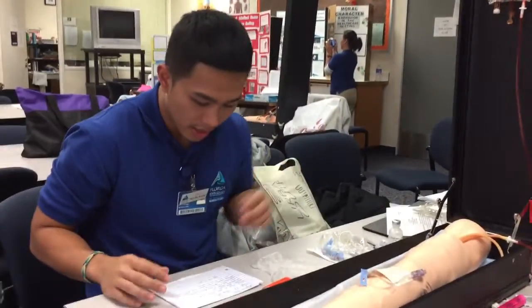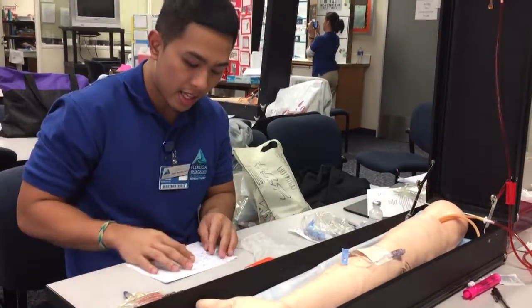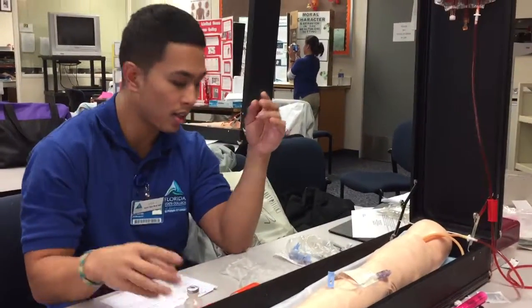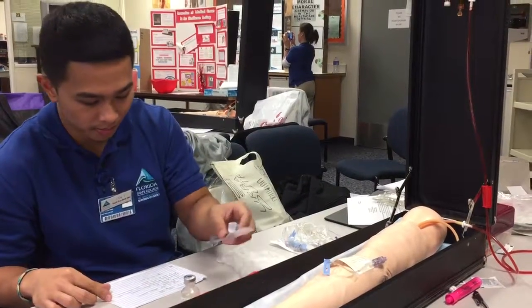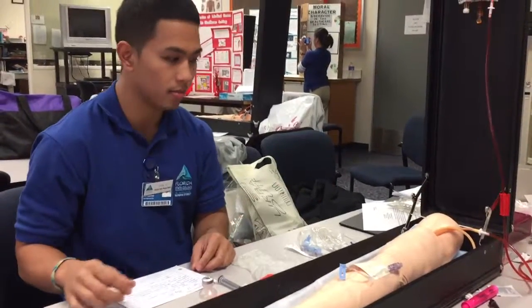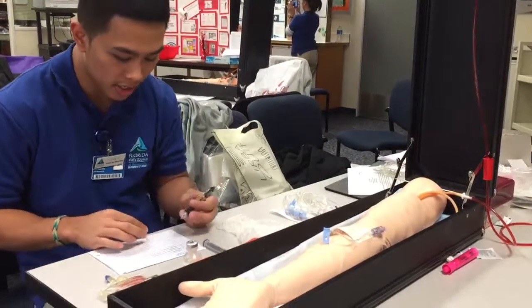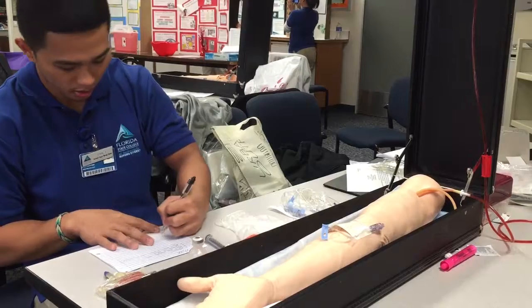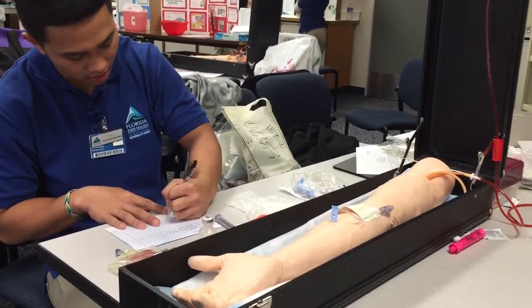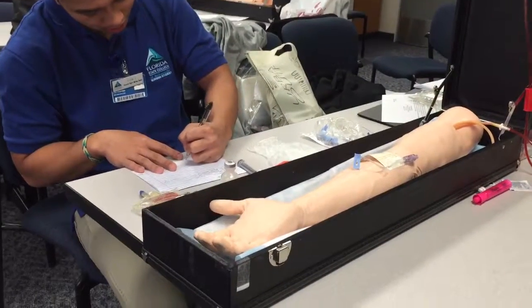So the first thing we're going to do is check the MAR also. So that's that. And then we're going to get the bottle of Flagyl right here, which is 1,000 milligrams per milliliter. So we're going to go ahead and do our calculations right here. It is 1,000 milligrams per milliliter, and we need 500 milligrams. So we're going to do 500 milligrams over X. So we're going to administer 0.5 milliliters of the Flagyl.